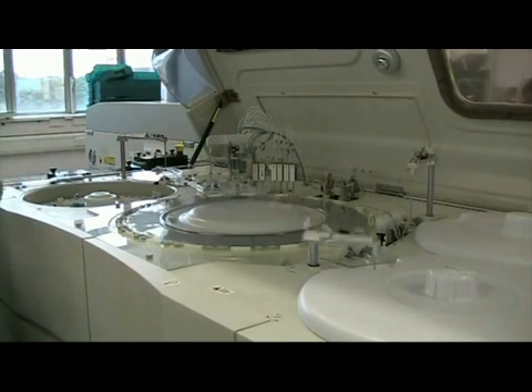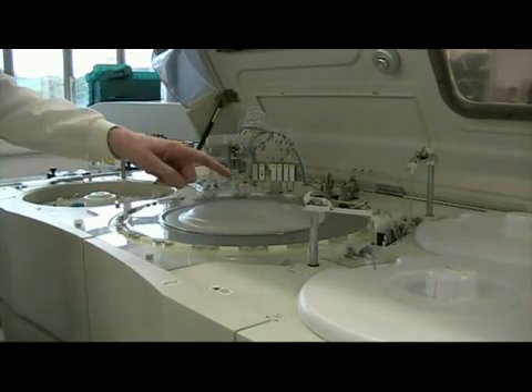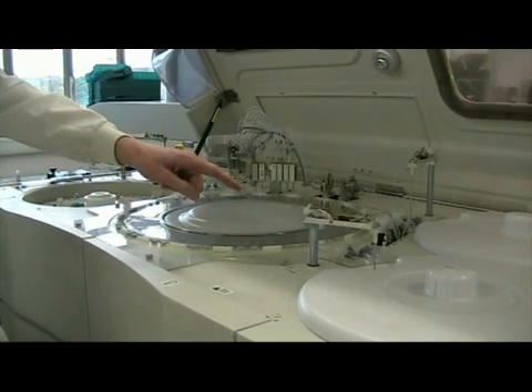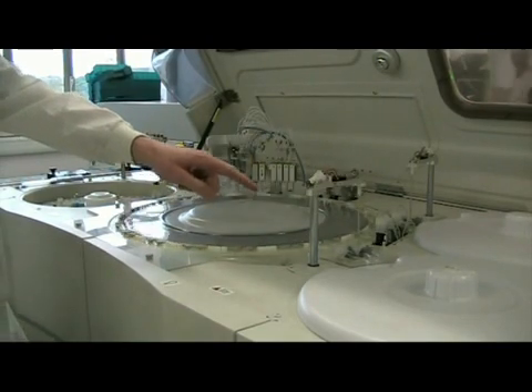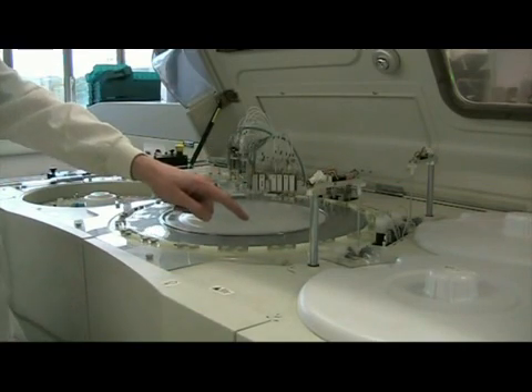It then goes through a quarter of a turn to here where it's putting in the reagents. We've got a reagent one probe which is moving reagent into the actual cuvette where the analysis takes place.